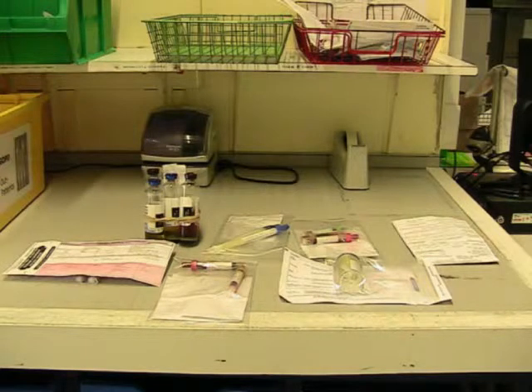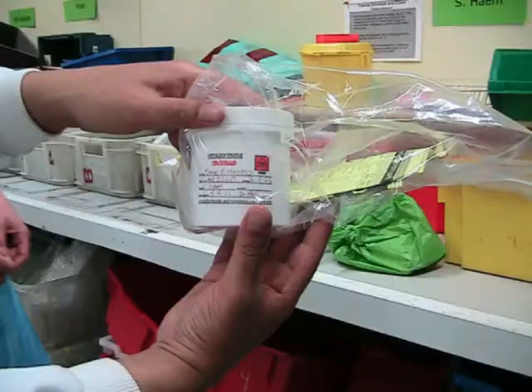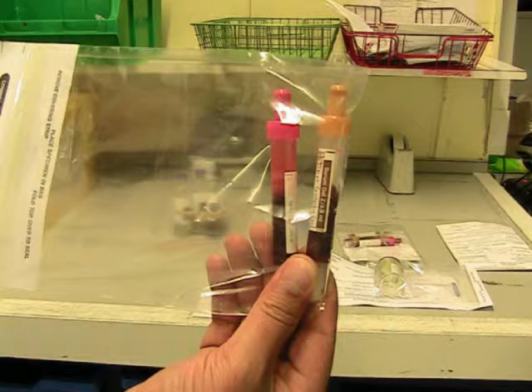Literally, these are the different types of samples that may come into this sorting out area. We've got some microbiology samples, and some additional microbiology samples there. For hematology and chemistry samples, we tend to have a pink or red top, which is an EDTA sample, and also a brown top, which is a gel. These samples will provide all the tests necessary, or some of the tests necessary, for hematology and biochemistry.